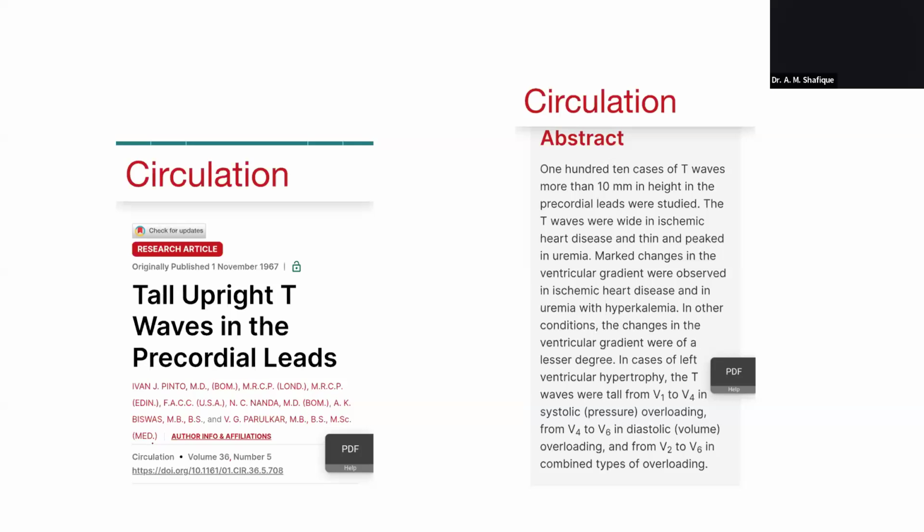Here, the patient is having hypertrophy, as well as volume overload and pressure overload. So definitely it fits well with this scenario, I do believe.